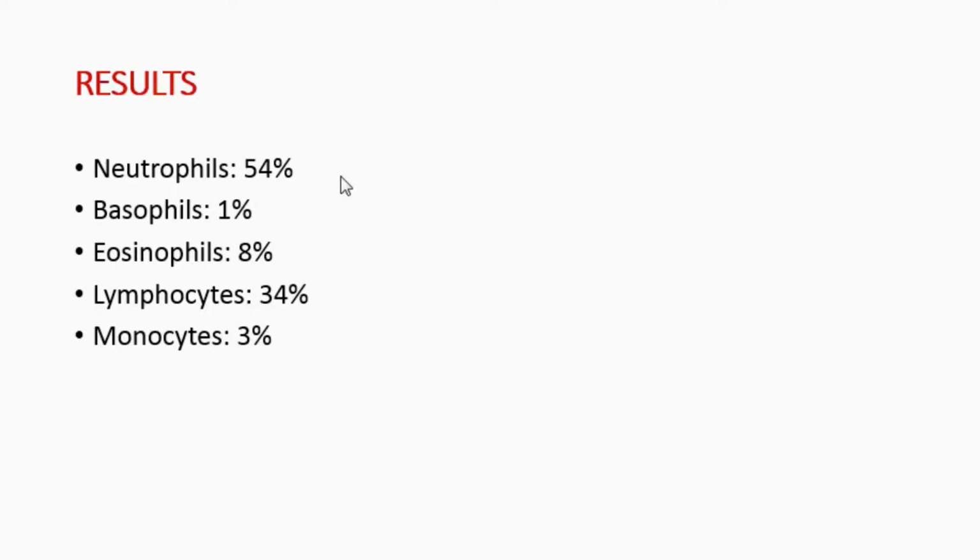The results of this practical are that we observed neutrophils 54%, basophils 1%, eosinophils 8%, lymphocytes 34%, and monocytes 3%.